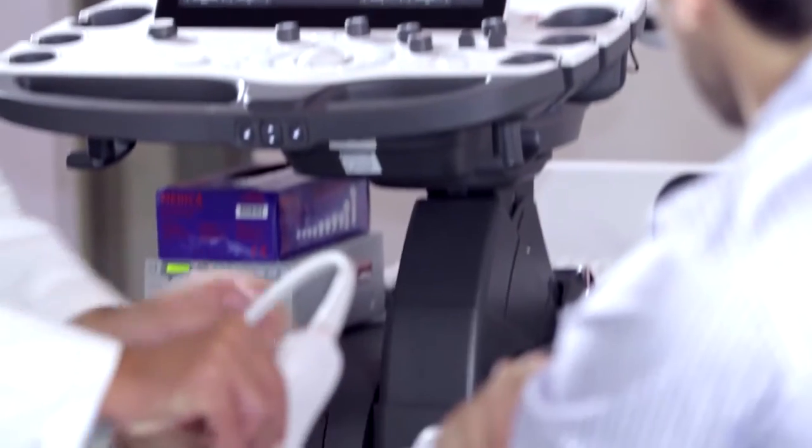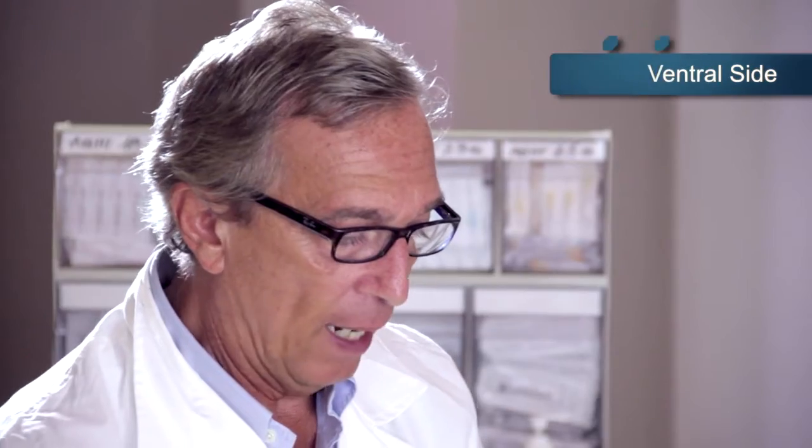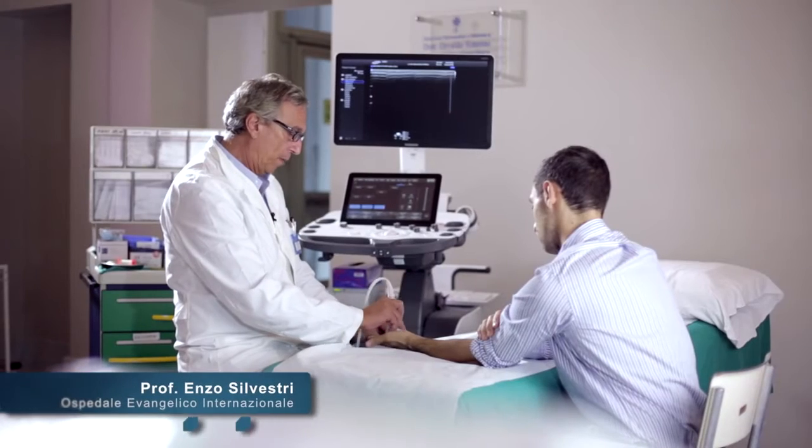We can now move to study and analyze the hand and its main components. We're going to study the flexor tendons of the fingers, the superficial and the deep one, at the level of the hand, doing very precise longitudinal scans to evaluate their aspect along the long axis of the tendons.